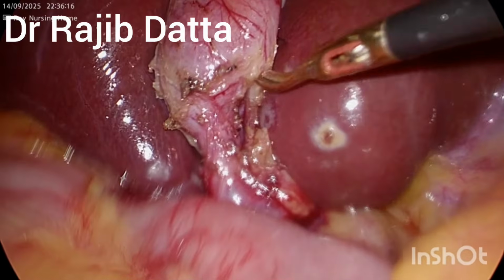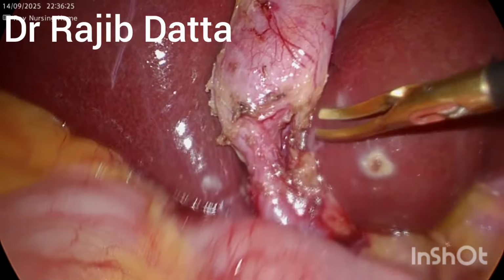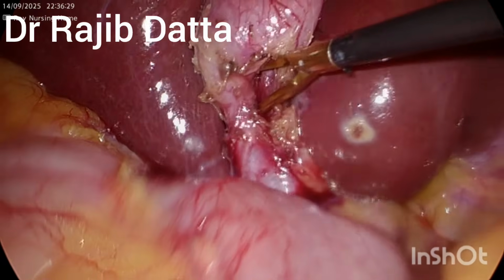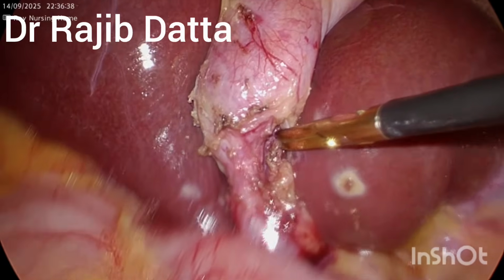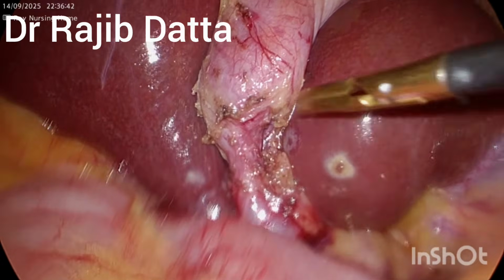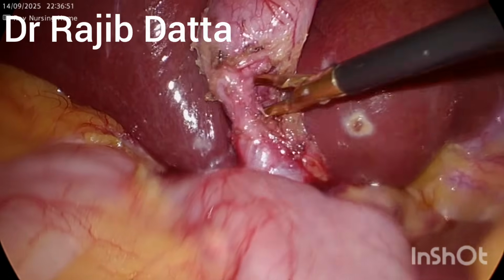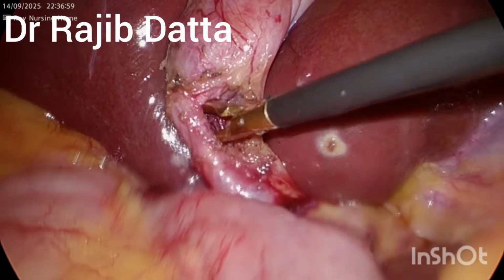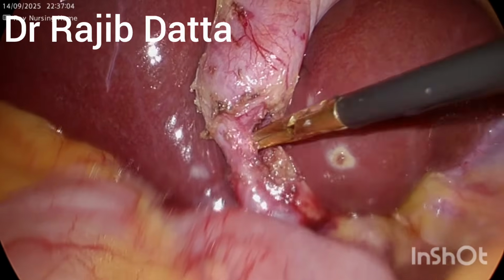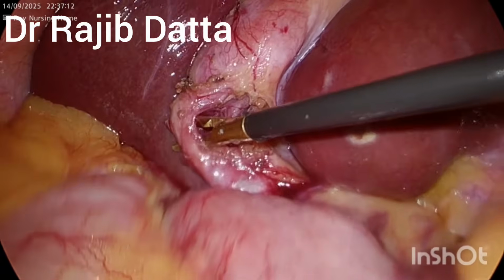So I am just separating it, and this fibrofatty tissue surrounding the lymph node of Lund has to be carefully and precisely separated for proper application of the Liga clip.